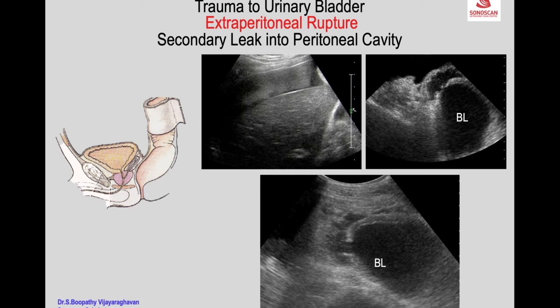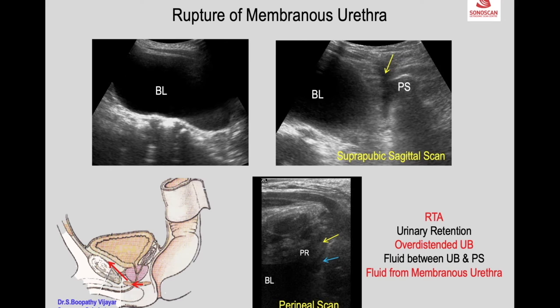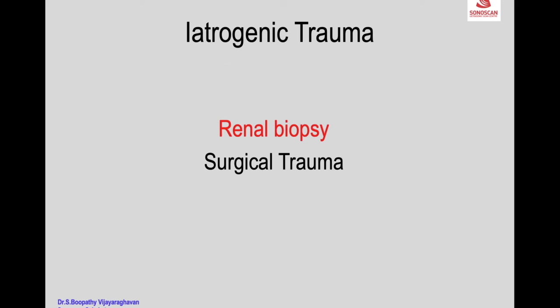This is a case of extraperitoneal rupture with secondary leak into the peritoneal cavity. You see the escape of fluid and urine from the bladder to the extraperitoneal space.